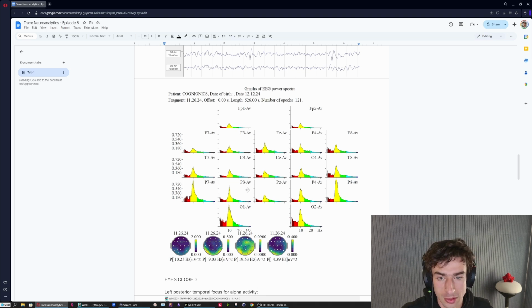In this case, you could do a bipolar montage of CZ to P7 and inhibit the alpha, reward the SMR band, and inhibit the beta band, which would have the potential benefit of activating that left temporal region and promoting more effective sleep onset, which over time we would hope would help clear up some of this frontal alpha activity in the eyes open.